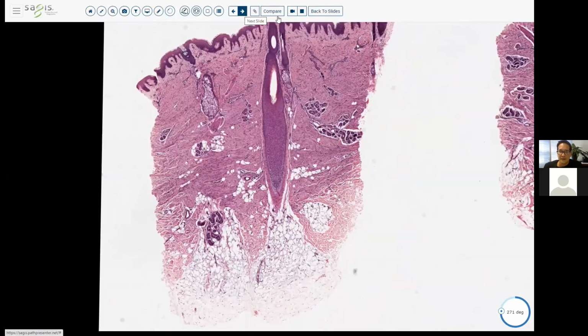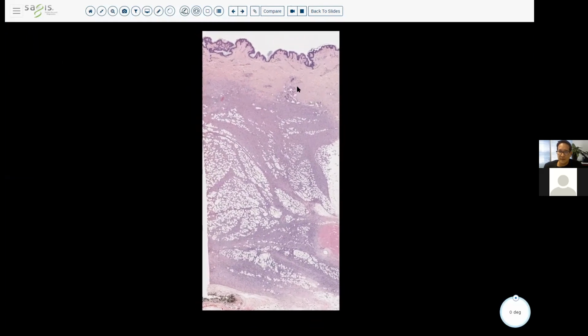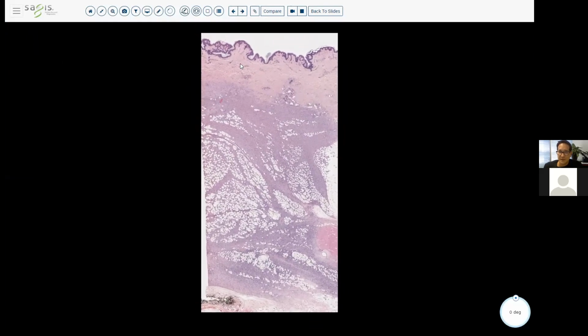Okay. Go to the next case. All right. This one's a little bit different from the previous two.